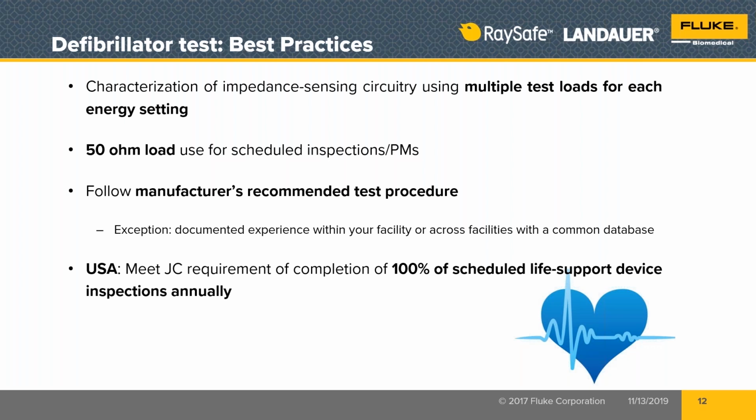And you know what it's going to do to their trust in you as a biomed and in your department? It's going to improve it. And I'm going to tell you that I have experience myself, having been the manager of 3 different biomed departments in hospitals. That's exactly what happens when you're able to have those kinds of conversations with the doctor or the nurse. So you can't just sit down in the biomed shop and wait for them to bring failed devices down to you. You need to engage. You need to make sure you're learning enough about physiology and so forth to be able to have those conversations, and you have the right test tools to be able to help you get that done.